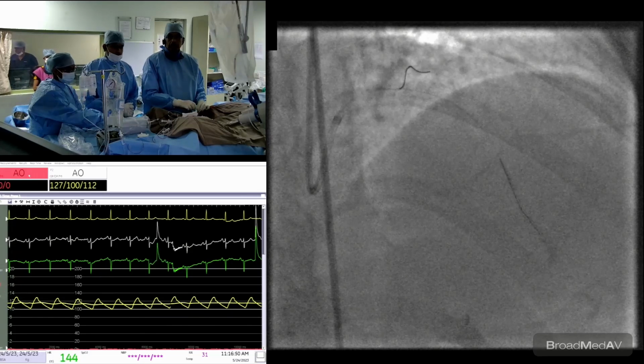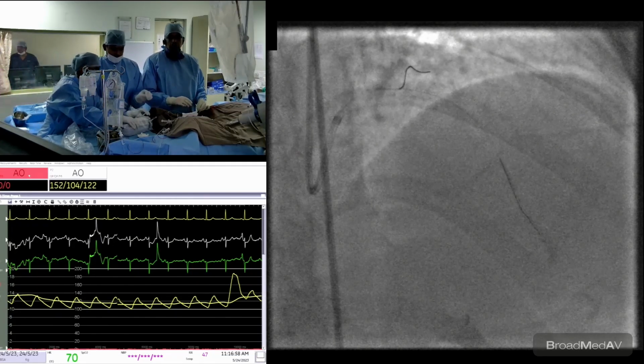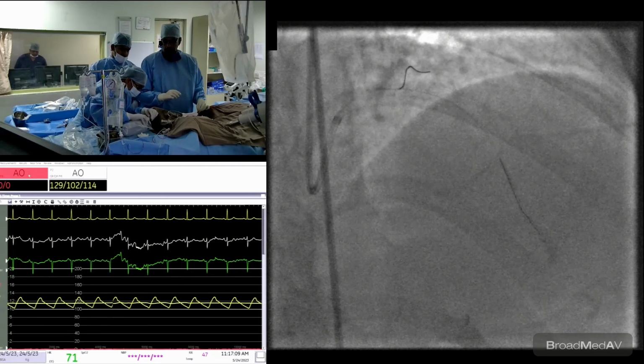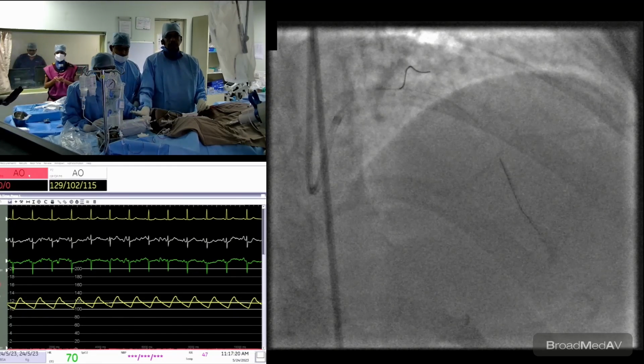Do you want to disconnect the catheter out? Yeah, the catheter has to be disconnected. Sister, you just disconnect and reconnect the catheter. Now press the button on top. Sister, you help her to reconnect. Yeah, perfect. Okay, it's connecting.